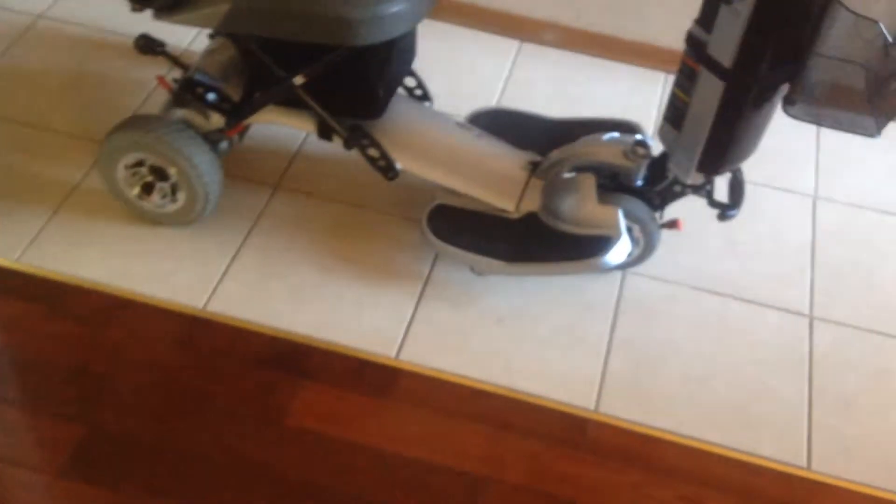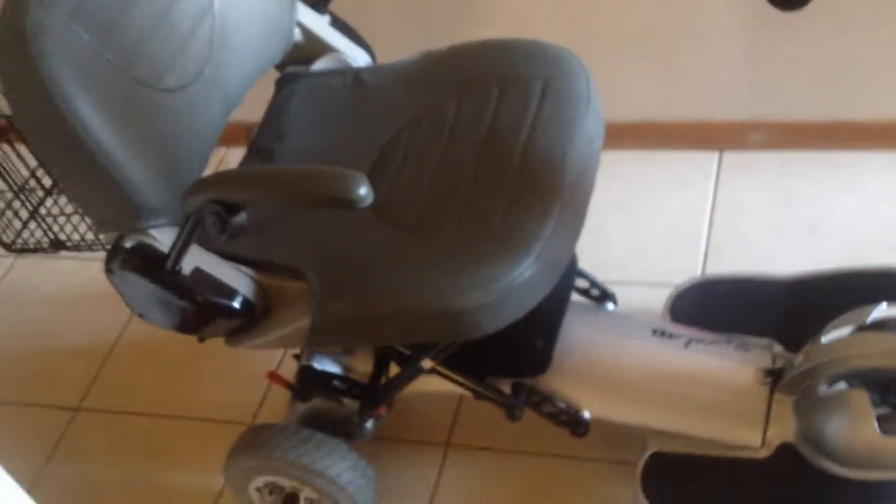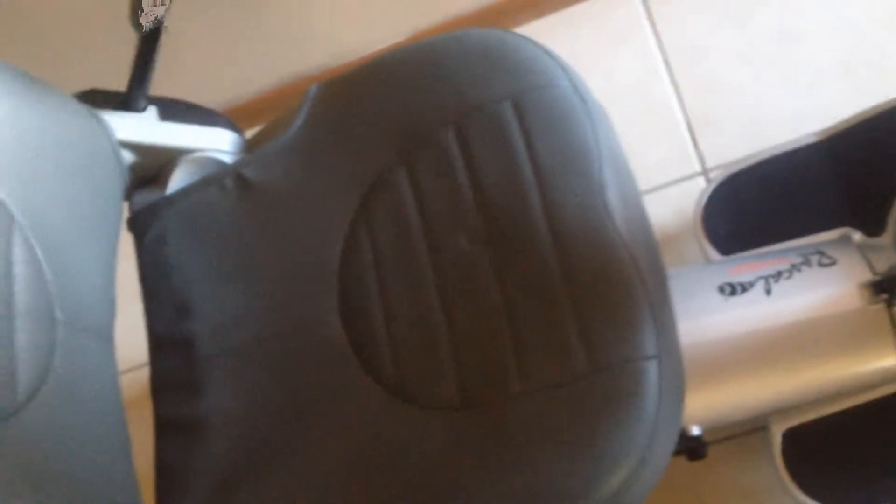Just like all the other scooters out there, this will hold about 300 pounds. It's got a nice generous seat — and I mean a generous seat — that's about 19 inches across, so even the girthiest individual could sit on it. Nicely padded with a nice backrest. It's a great, comfortable seat.